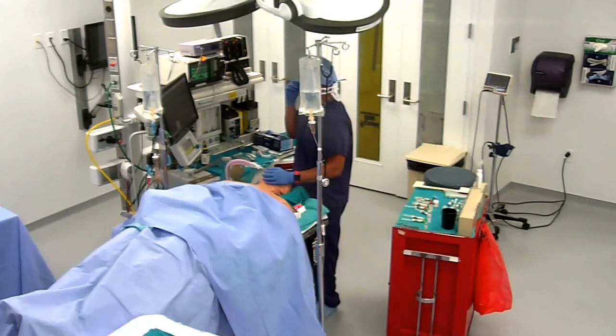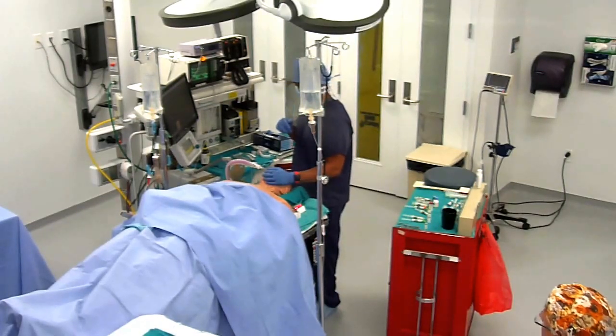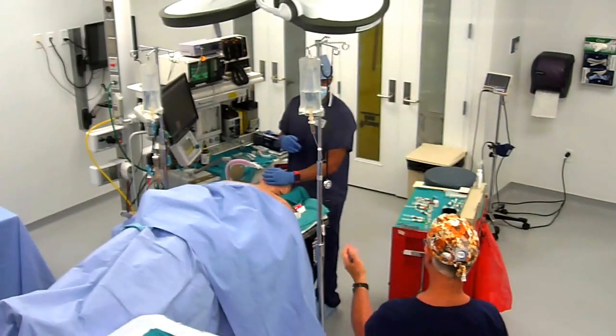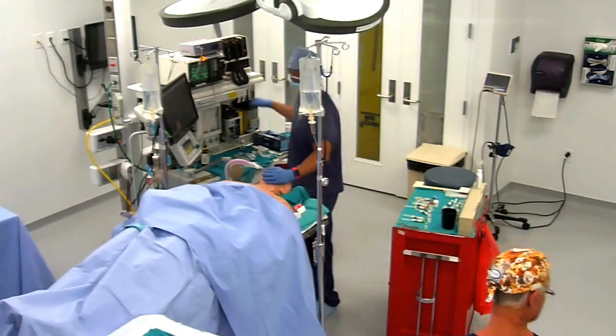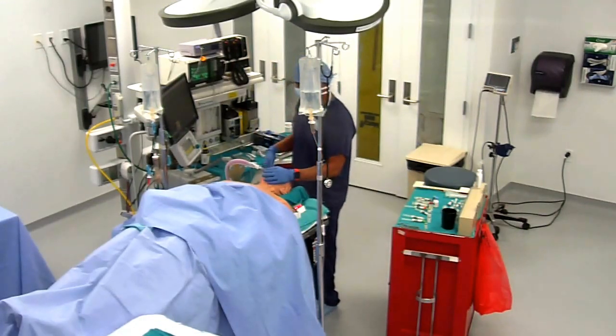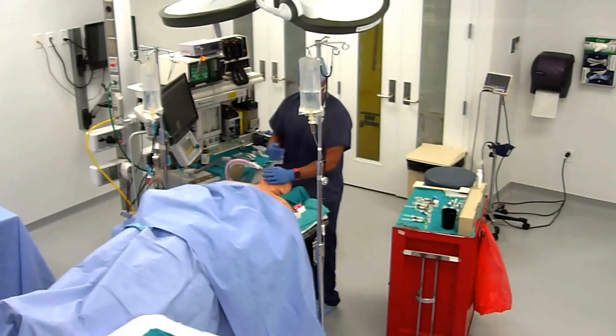Good. Everything's gone good. The surgery's actually getting done. They're beginning to close. Okay, first thing I want to turn off my gas. Now that they're starting to close, I want to go ahead and give some Zofran.